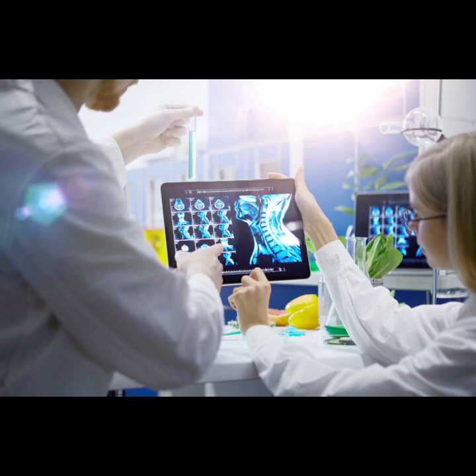Which means the contrast we see is much more dependent on the actual tissue properties, which is great for clinical diagnosis. Hugely valuable. It lets us isolate and see differences based on T2 values, which vary significantly between healthy and diseased tissues. All right. Physics defined, decay mechanisms understood.